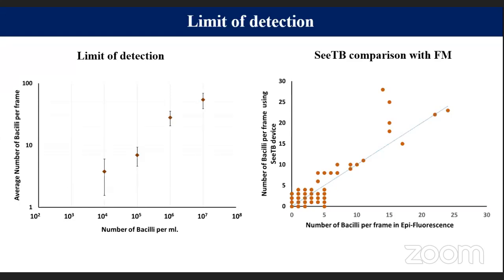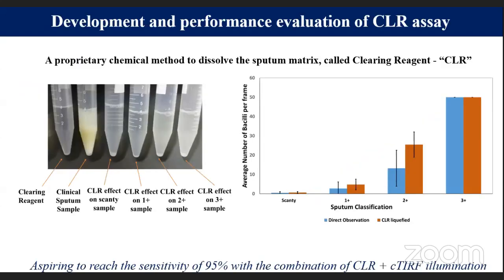for a microscope. And if I compare my own SeeTB test with the existing fluorescence microscopy test, you can see that the bacilli visible in SeeTB and epifluorescence are overlapping, and sometimes SeeTB could see a few more bacilli which were missed due to the high background in the fluorescence microscope. You can see how the CLR reagent which we have developed works better, and how it makes an enhancement in this existing SeeTB test.